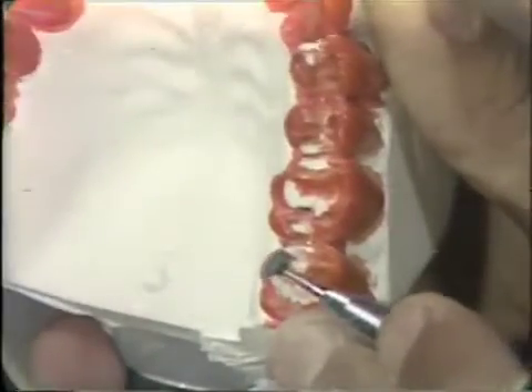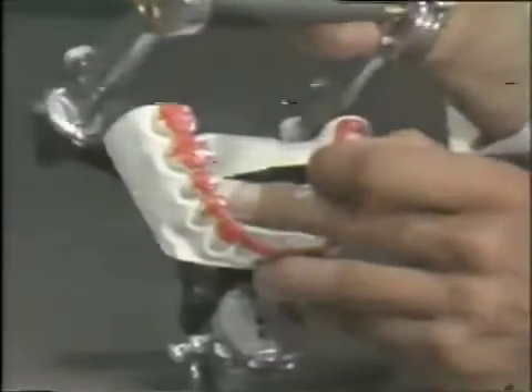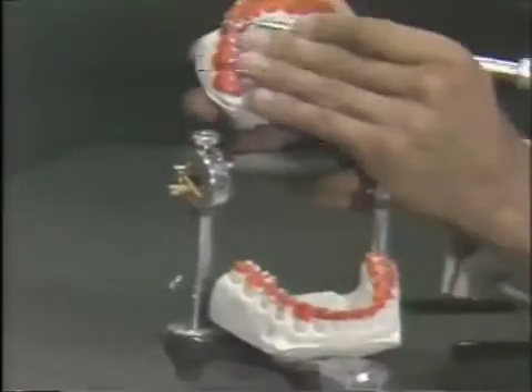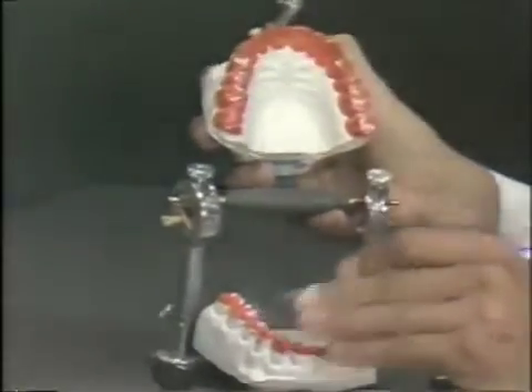The first molar is free from contact and balancing at this particular time, except for a little area right in here — and this is what we'll remove next. We'll take a slight amount of this off; that should fulfill our requirements of no balancing. We'll take this off the first molar. If we go over to the other side in the maxillary arch, we find that we have a little contact here. Going to the lower, there is again a slight contact down here, so we will remove that contact slightly on the upper, and just a touch down here on the lower, to get that last little area.